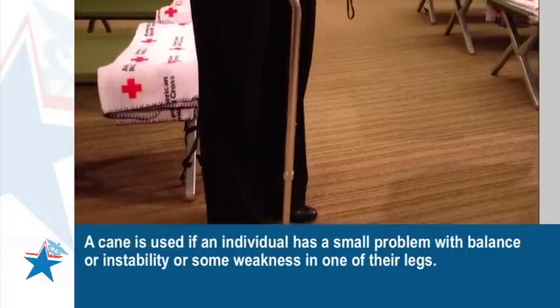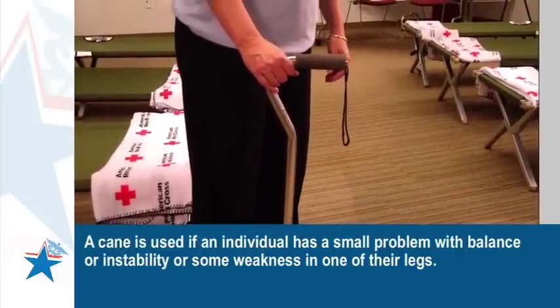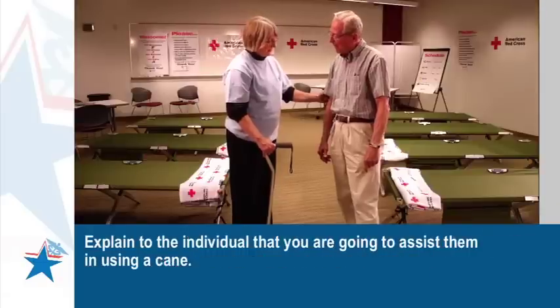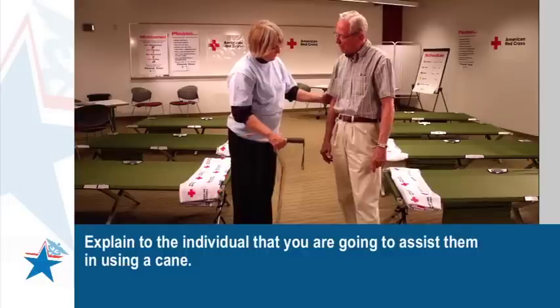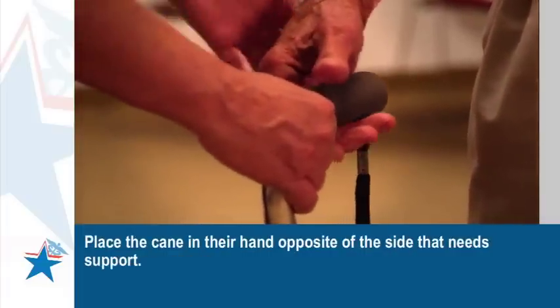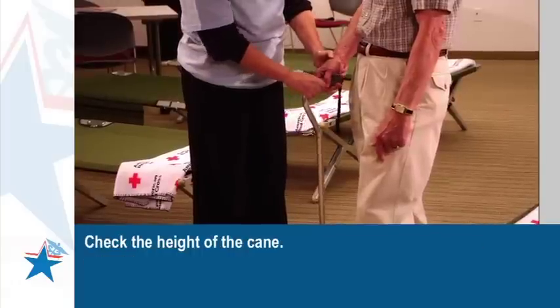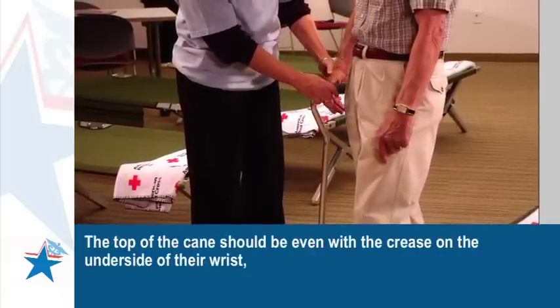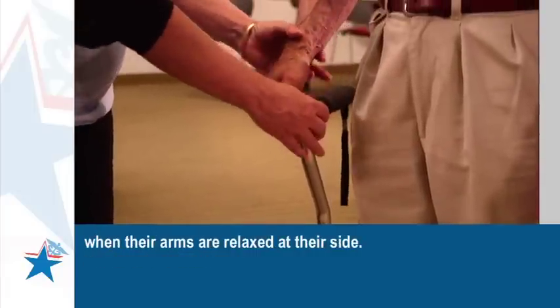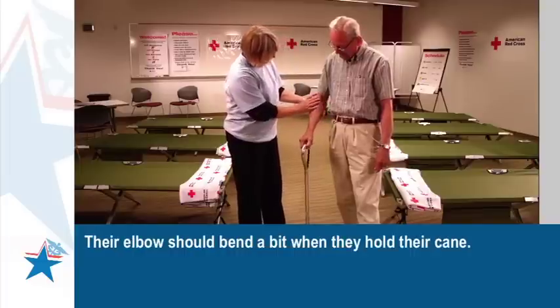A cane is used if an individual has a small problem with balance, instability, or some weakness in one of their legs. Explain to the individual that you are going to assist them in using a cane. Place the cane in their hand opposite of the side that needs support. Check the height of the cane — the top should be even with the crease on the underside of their wrist when their arms are relaxed at their side. Their elbow should bend a bit when they hold their cane.